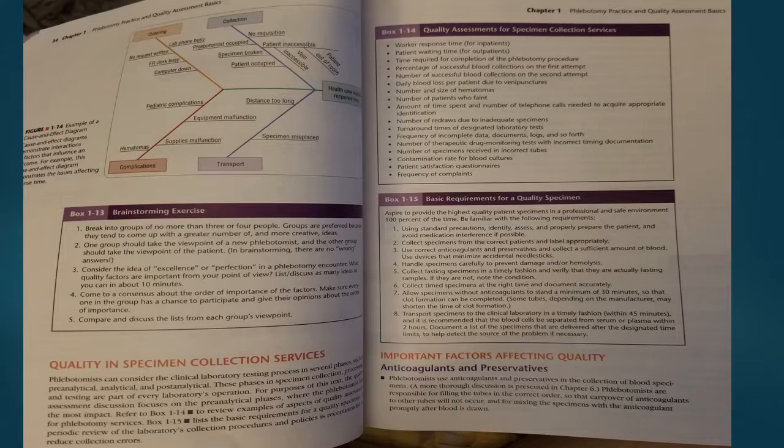Management administrative structure: updated available procedure manuals, adequacy of systems for secure record keeping, and open lines of communication throughout the organization. Quality assessments of structural components may reveal potential problems that other assessments cannot. For example, the use of outdated blood collection tubes may cause faulty laboratory results, even though the blood collection testing and reporting processes are perfect and the treatment plan for the patient is appropriate.